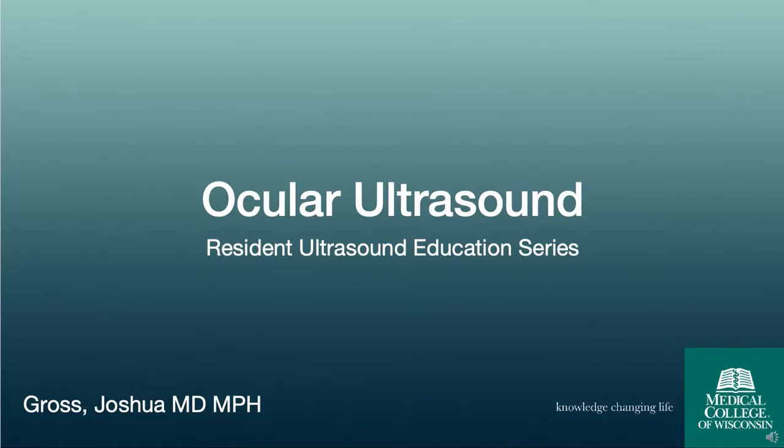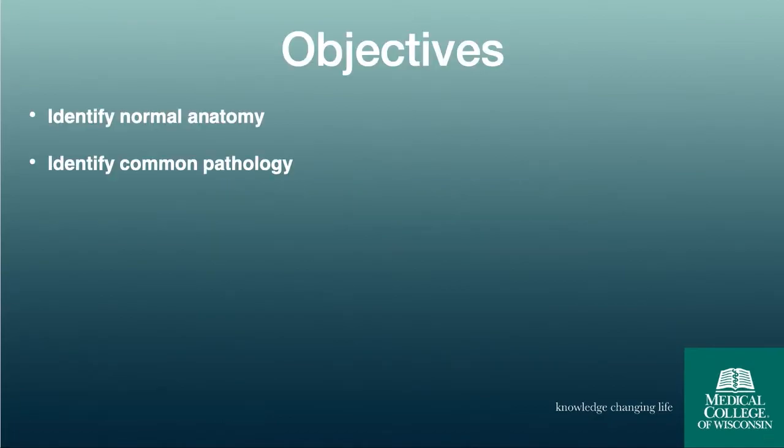All right, I'm Josh Gross. I'm one of the third-year ER residents. Today, I'm going to be talking about ocular ultrasounds as part of the resident ultrasound education series.